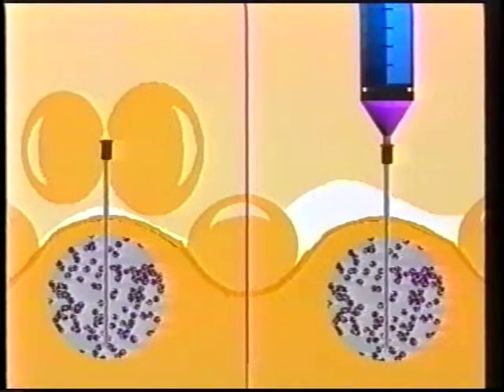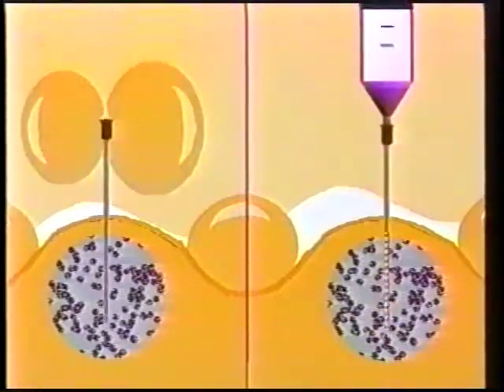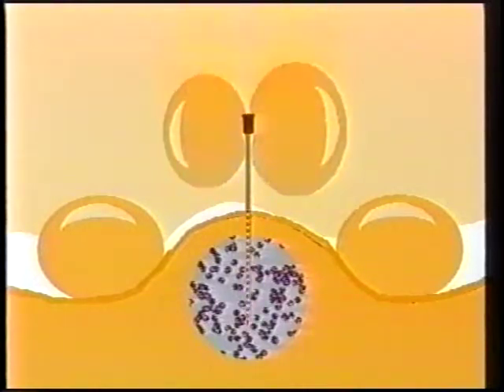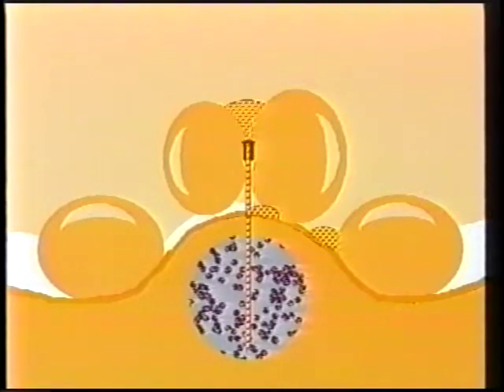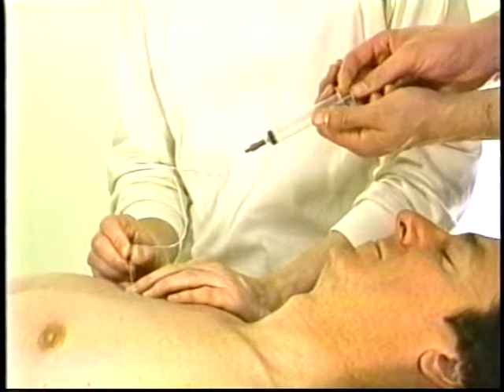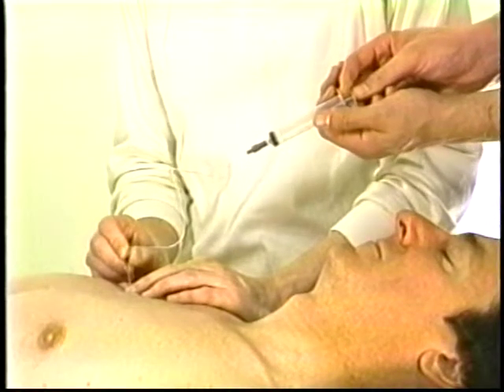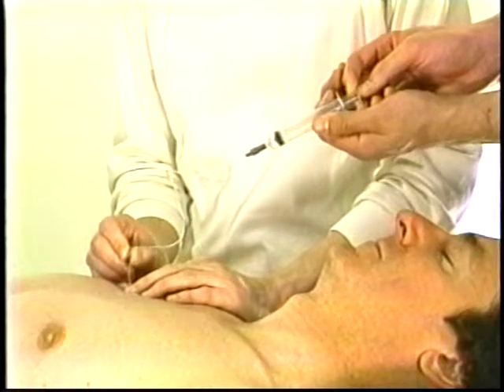One disadvantage of the needle-only technique is that on the average, it appears to yield less material. In some cases, in my experience, there will be a dry tap, while subsequent samplings using aspiration will yield diagnostic material. Further, if the lesion is cystic, there may be overflow. This may be alleviated by attaching a syringe barrel that will catch the fluid. In order to get the advantages of both techniques, one can attach tubing and a syringe to the handheld needle and have an assistant apply suction during the sampling.